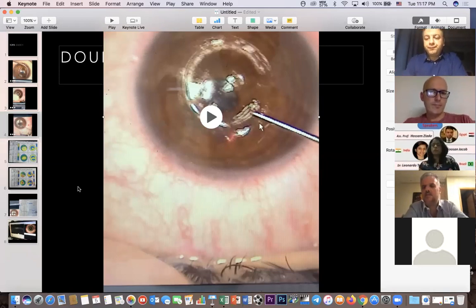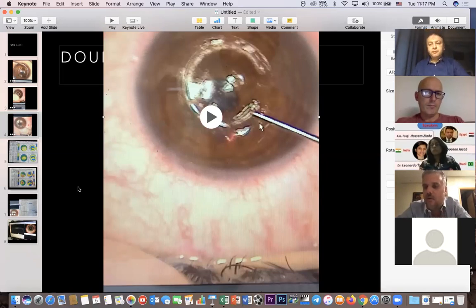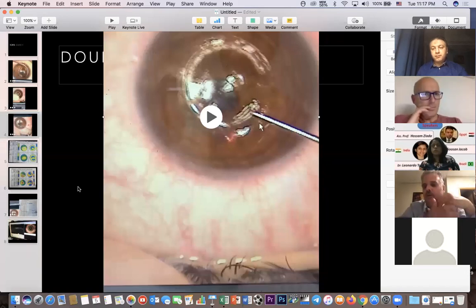Fay. Yes. So I choose the rings, it all depends on a lot of parameters. The first parameter I look for is the high order aberrations. If there is a coma, if it is a decentered cone, I will choose one ring. If it is a central cone, I will use a big ring to try to treat the high spherical aberration. For astigmatism, I put it at the second level because I want to treat the high order aberrations that we cannot treat with glasses or with phakic IOLs. So I try to treat high order aberrations in the first step, and if I can treat the astigmatism at the same time, I can do it.